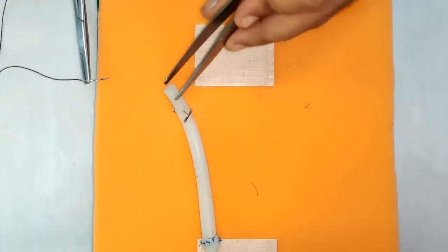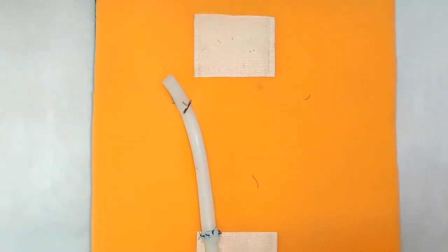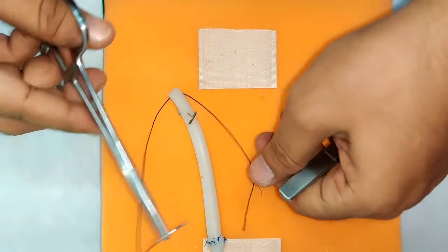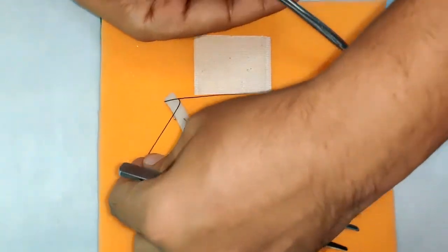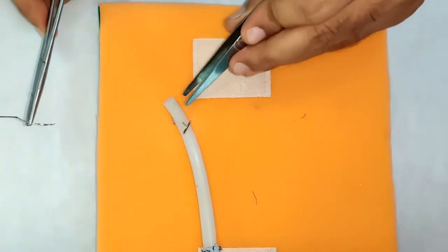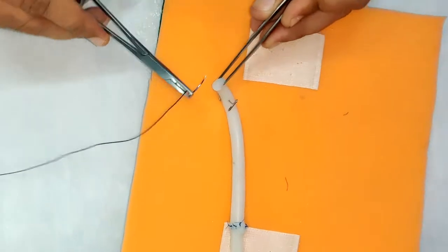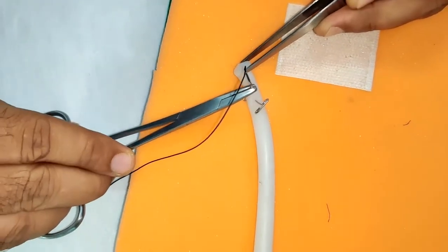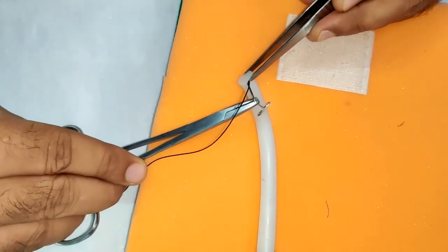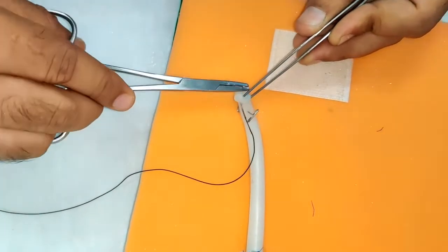If you have a long pedicle or a big blood vessel, simple tying will not give you hemostasis. Instead, you are required to take transfixation sutures. In transfixing, what you are doing is holding the pedicle and passing the needle through the pedicle and coming out.